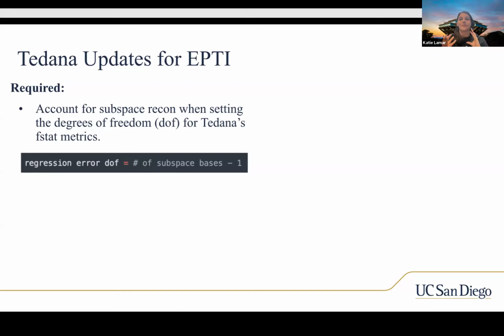And so in order for tedana to work, we had to change the degree of freedom. Otherwise, a lot of the values were just really high, and now the decision tree got all confused, basically. So it was all scaled up. So that was the first change that we made. And this allows us to actually use the decision tree that tedana has. Otherwise, basically all of our task components got rejected immediately. But then we also had the question, can we do more because we have more echoes?